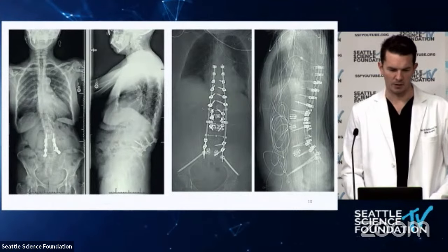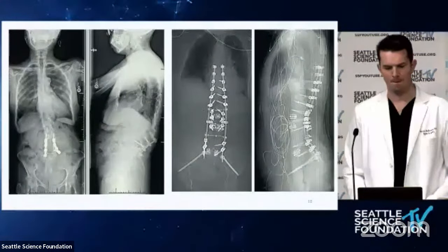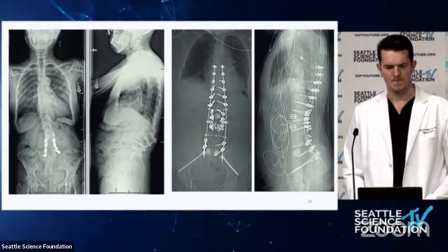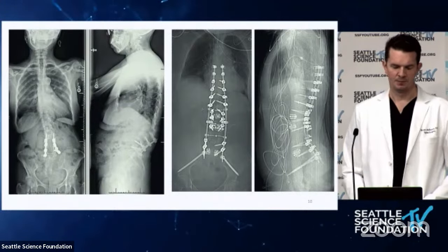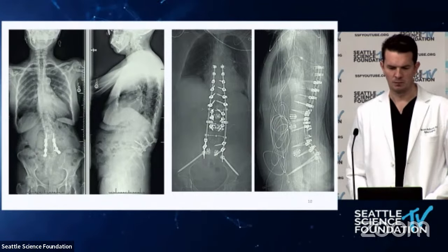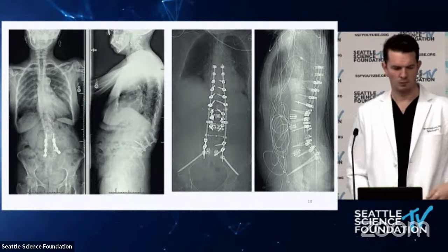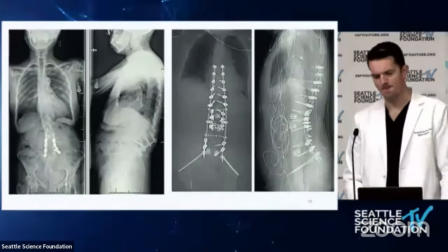demonstrating the correction of her deformity. We did this as a single stage just posteriorly, and again went through the pains of doing almost a subtotal corpectomy, the lower 40% of the vertebral bodies, and washed that all out. I was very pleased with our interdiscal osteotomy technique. It was actually not that hard to take out that cage, and we did an osteotomy at the level next to that. And you're very, very astute, Dr.